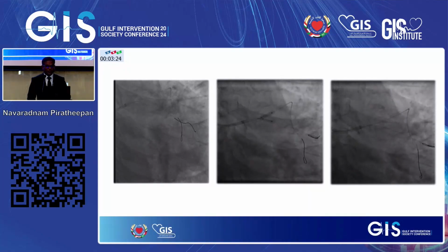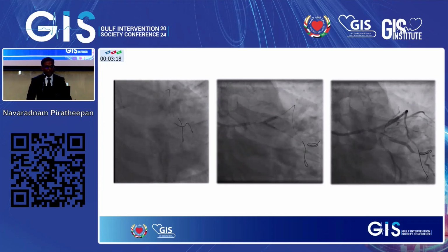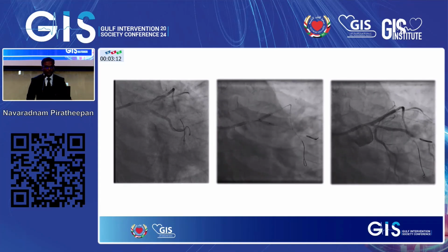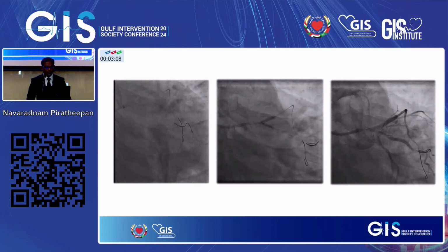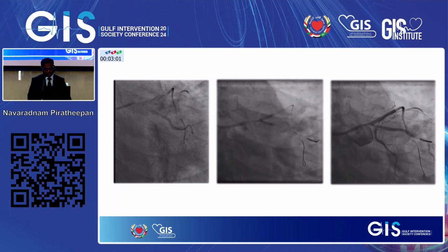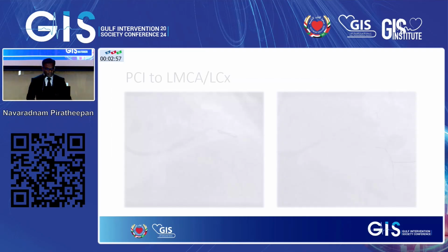So we again tried our unconventional technique, maybe the guerrilla technique. We put two balloons simultaneously in the LAD and LCX and tried to pull it out. Fortunately or unfortunately, the balloon remained there. The third picture shows that we tried twice. We didn't do further.